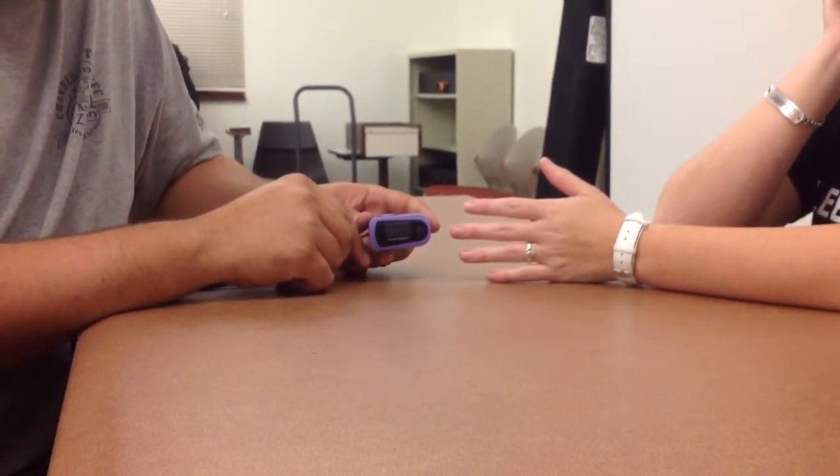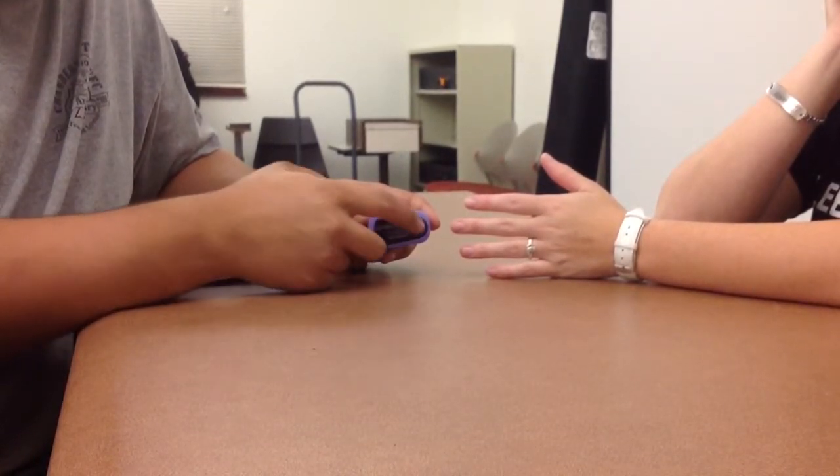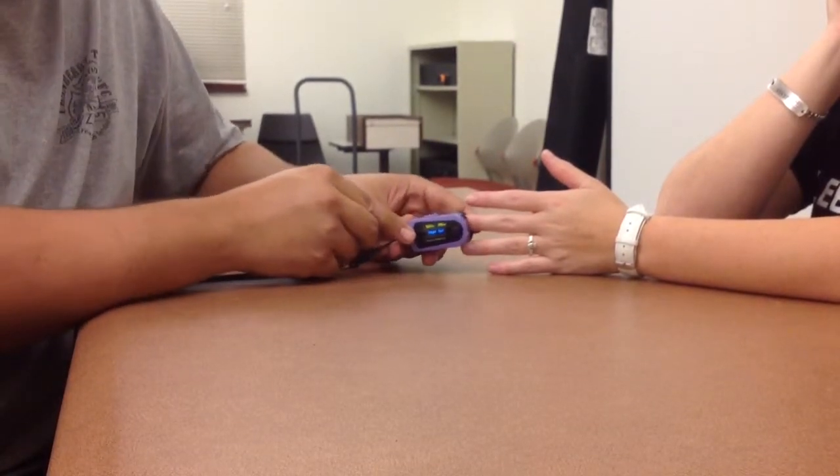This is a pulse oximeter, commonly used to measure the level of oxygen circulating through a patient's blood vessels. To use the pulse oximeter, you first turn it on and then place it over the patient's finger.